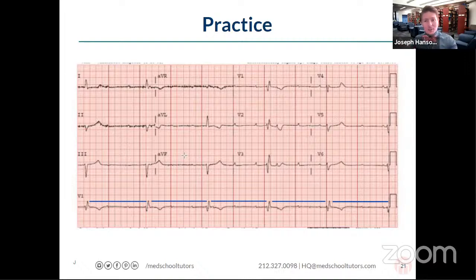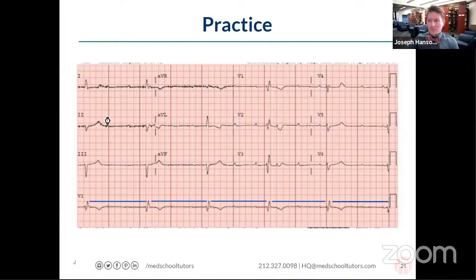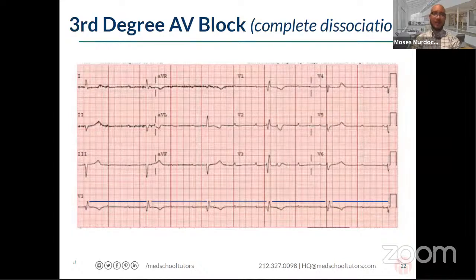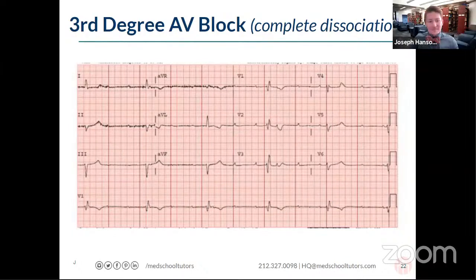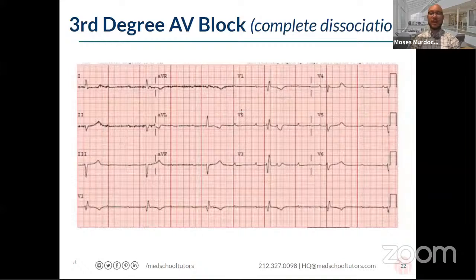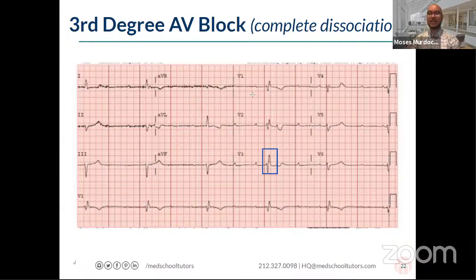Sometimes you see weirdness in the QRS complexes — some look slightly different from others — because a P wave is superimposed on top of a QRS. You won't see that every time, but if the P waves are marching out at their own rate and the QRS complexes are also doing their own thing, that's a big clue. Otherwise, regularity of the ventricular rhythm is the key to identifying third degree heart block.